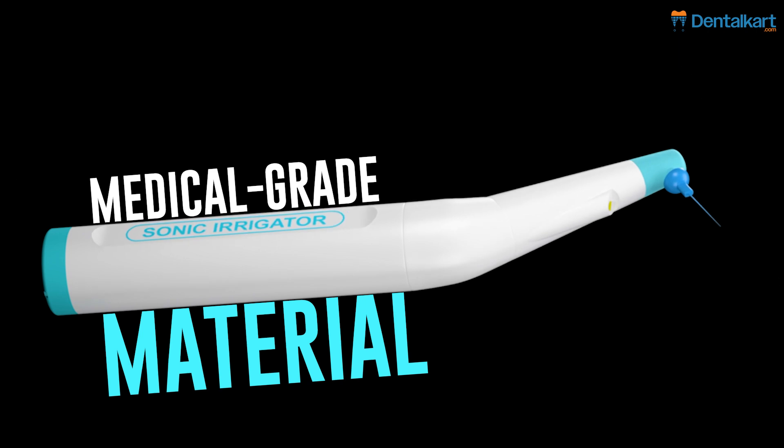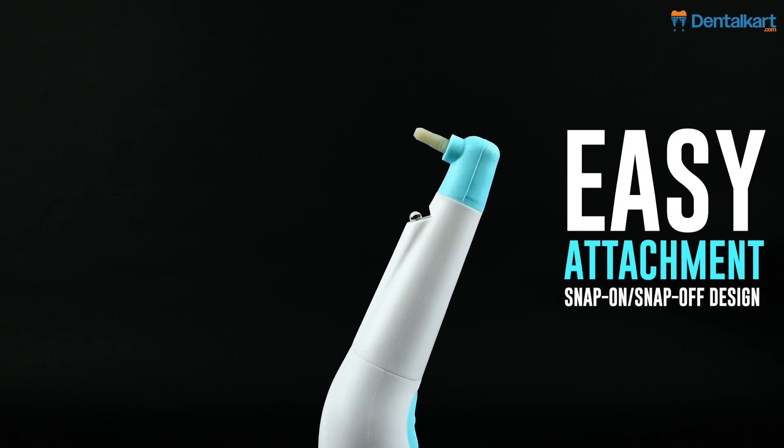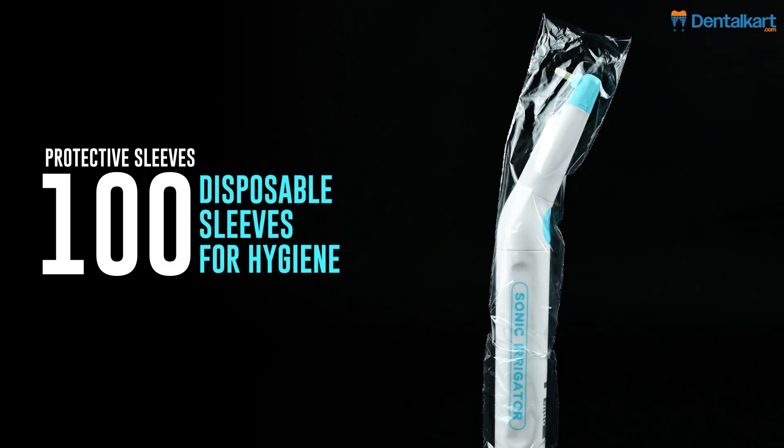Medical-grade material: strong and flexible polymer tips. Easy attachment with a snap-on, snap-off design for quick use. Protective sleeves: 100 disposable sleeves for hygiene.